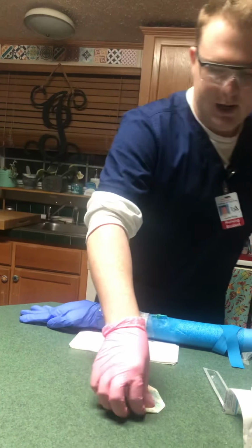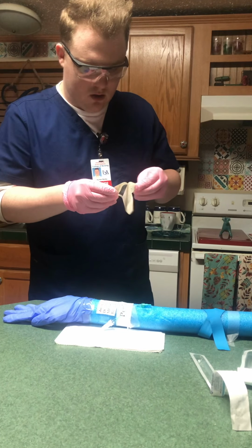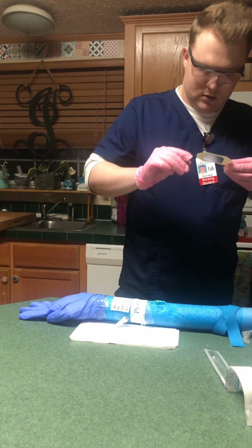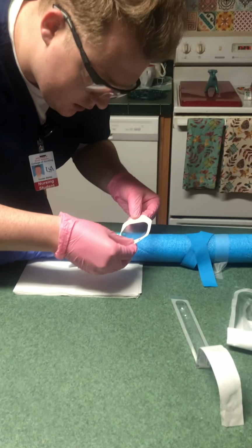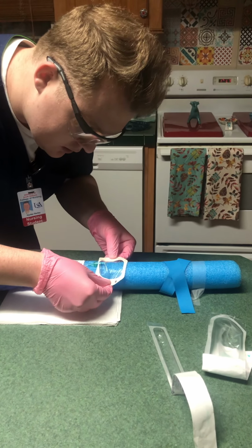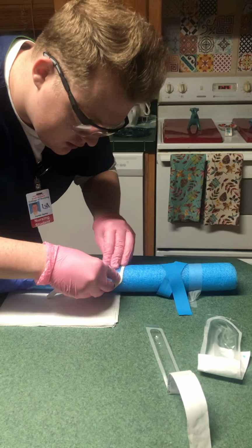So now I'm going to get my Tegaderm. I'm going to open it and dispose. And I'm going to tape right here over the catheter, but not the injection port. Just like that.